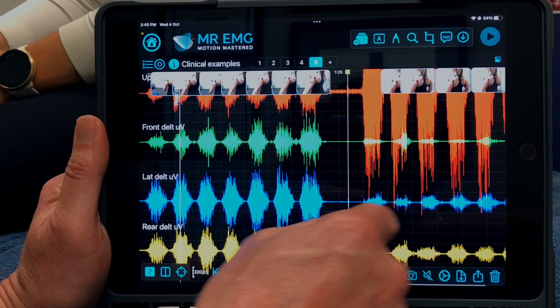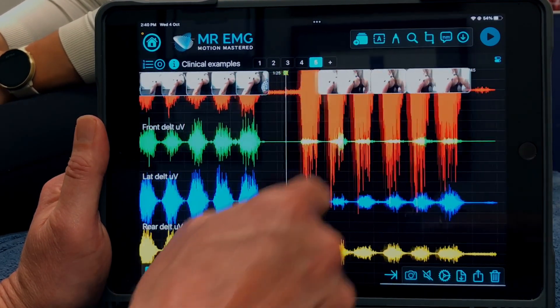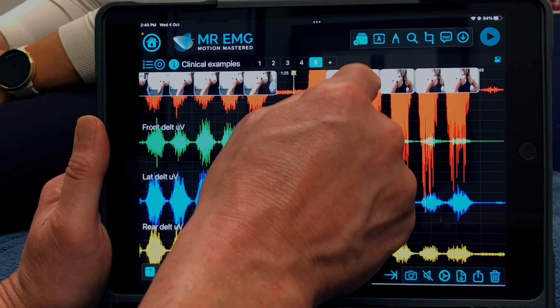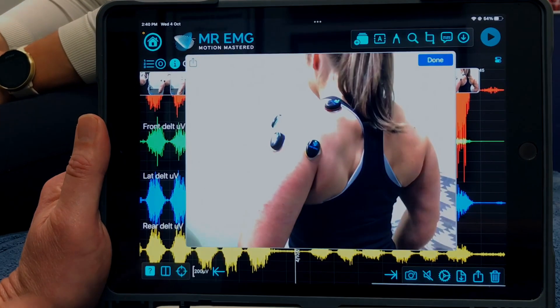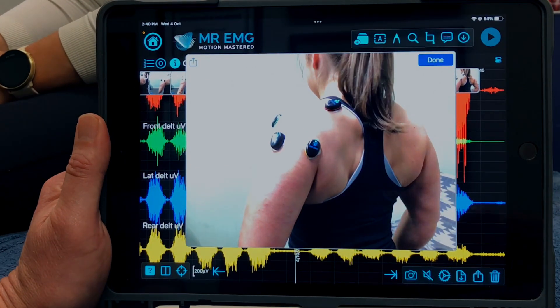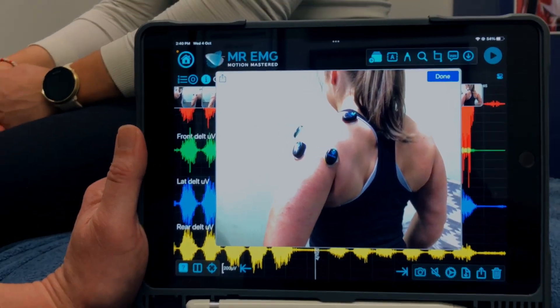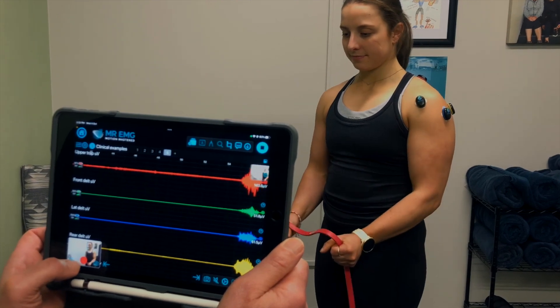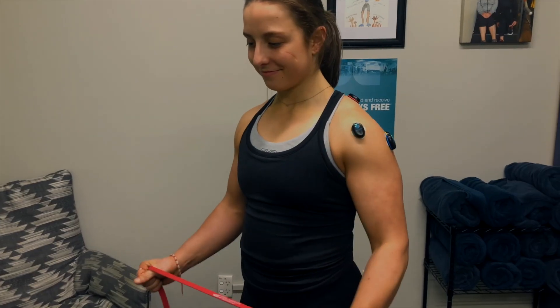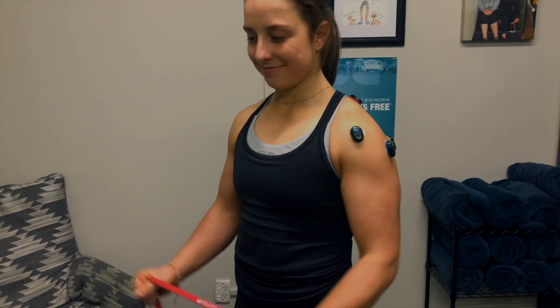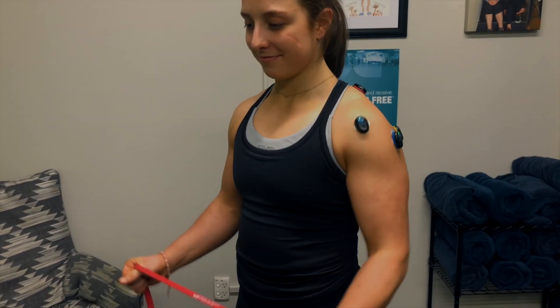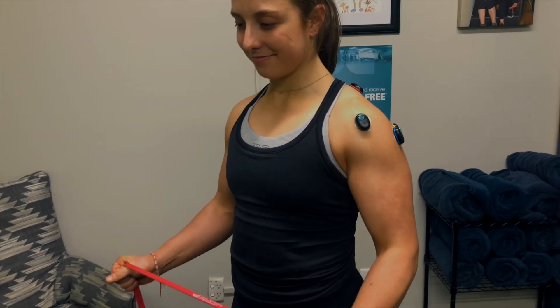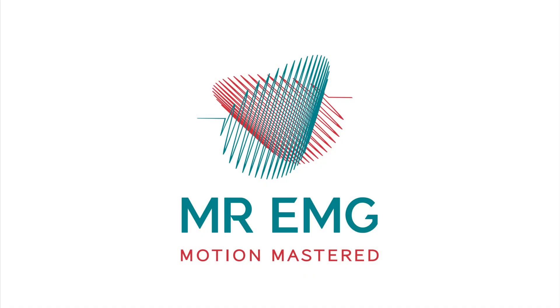Repeat these steps for the other shoulder for comparison if necessary. This is an objective, repeatable clinical experiment to help patients with shoulder pain and to target exercise prescription. Test the muscle functioning of the shoulder quickly using mrEMG.